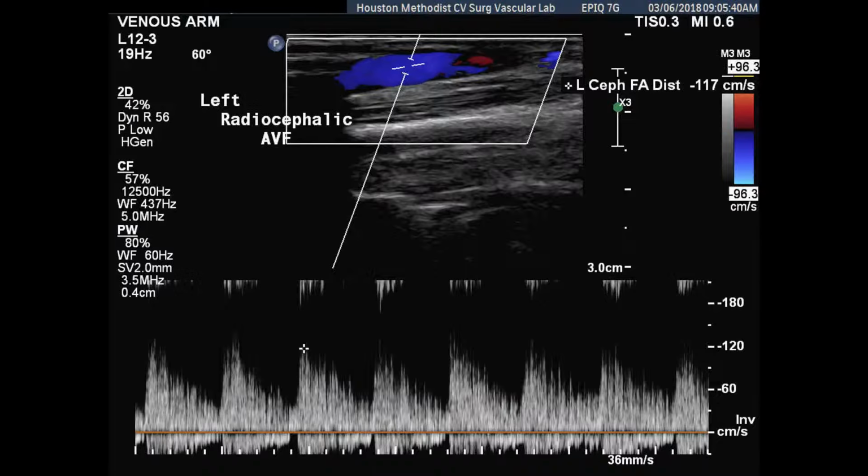Thank you. And here's my flow disturbance. Usually I call it an unorganized waveform when you see this. Too bad with our ultrasound we're really not recording these sounds, because it's hard to add that sound quickly, but I'm still waiting for that ultrasound machine which is going to give us that sound. When you see these waveforms, you really would like to hear that sound. Definitely the systolic upstroke is still there despite it being behind that stenosis. That's for me one stunning.